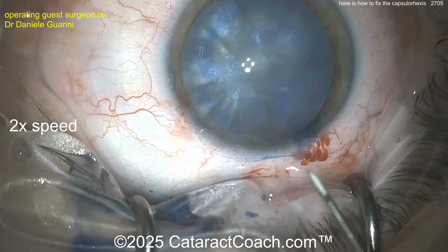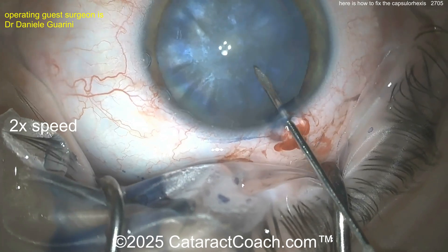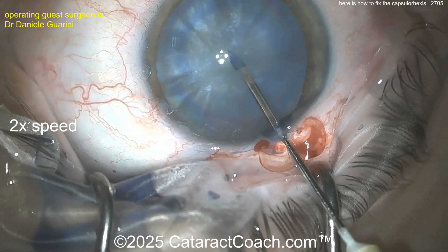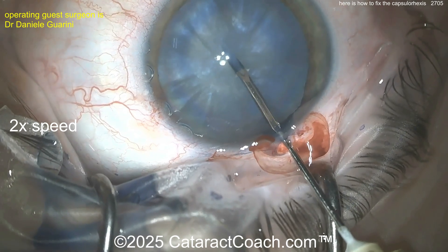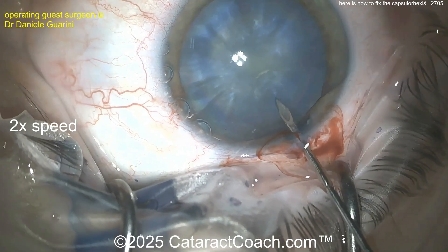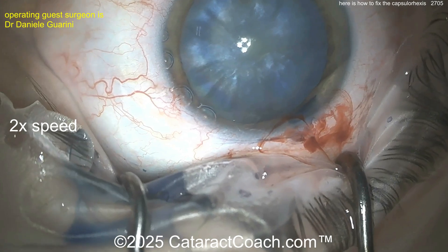Here is a tough case — an intumescent white cataract, certainly a white cataract. Trypan blue dye is there. Here comes the needle, 27 gauge to decompress, puncturing the lens capsule, aspirating a little bit more. That looks pretty good. Remember to rock the nucleus too, back and forth a little bit to release all the liquefied lens material. And that again looks pretty good.